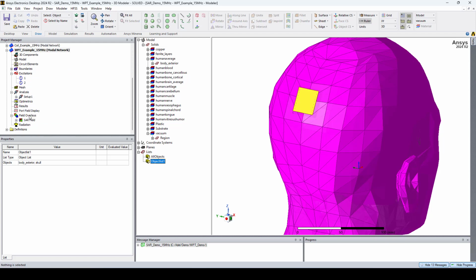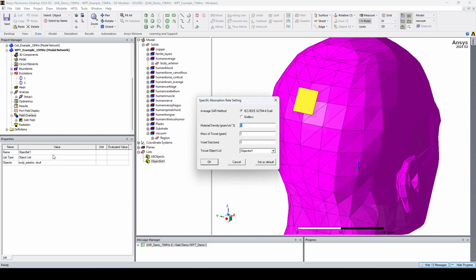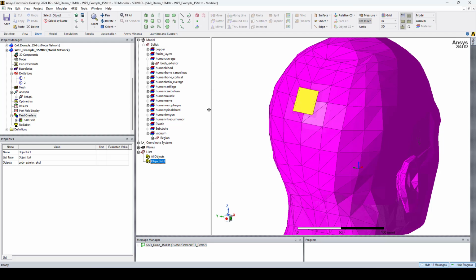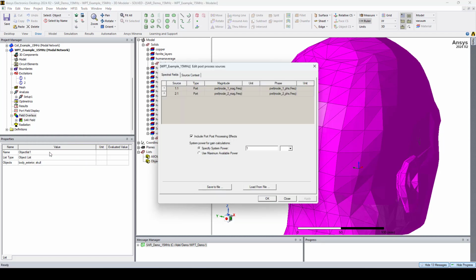Now, if I go to Field Overlays, right-click on it, and go to SAR Settings, you can see that I selected that object list. And here, the SAR averaged over 1 gram of tissue is calculated using the recommended IEC IEEE method. We can also check the input power through the Edit Sources window. So here you can see that our input power is 1 watt.